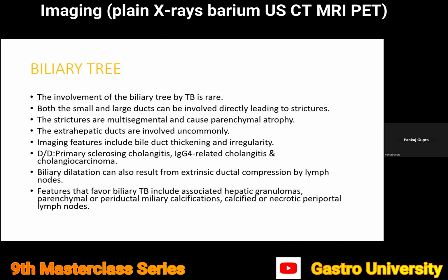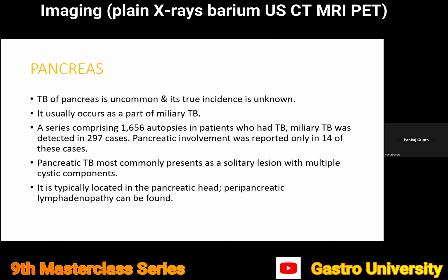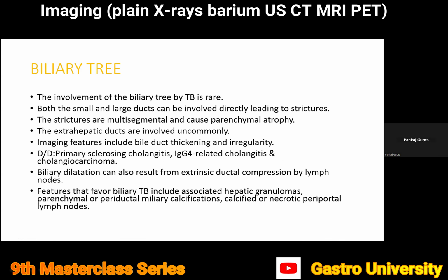Biliary tract involvement is rare. I don't have examples to show here, but I would like to point out that the features that should lead us to think about biliary TB or tubercular cholangitis are the presence of associated findings of hepatic granulomas or calcified necrotic locoregional lymph nodes and periductal calcification.